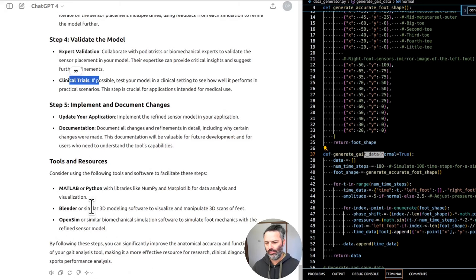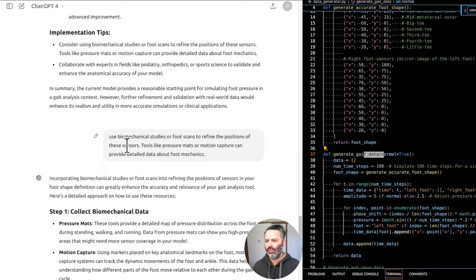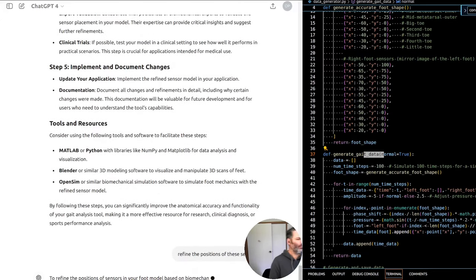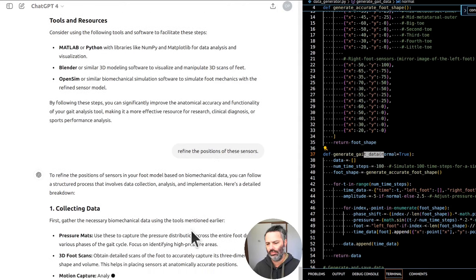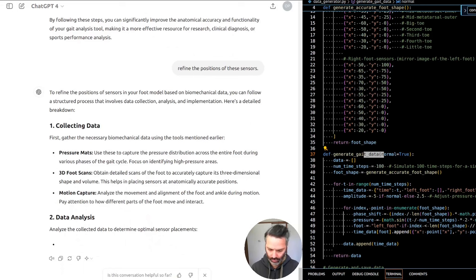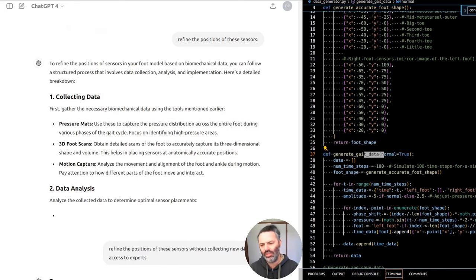3. Dynamic adjustments. Adjusting for foot movement and deformation. Real feet change shape and position dynamically as weight shifts and muscles contract. Incorporating elements that can adjust the sensor points dynamically based on simulated or real movement data could be an advanced improvement. Implementation tips. Consider using biomechanical studies or foot scans to refine the positions of these sensors. Tools like pressure mats or motion capture can provide detailed data about foot mechanics. Collaborate with experts in fields like podiatry, orthopedics, or sports science to validate and enhance the anatomical accuracy of your model. In summary, the current model provides a reasonable starting point for simulating foot pressure in a gait analysis context.